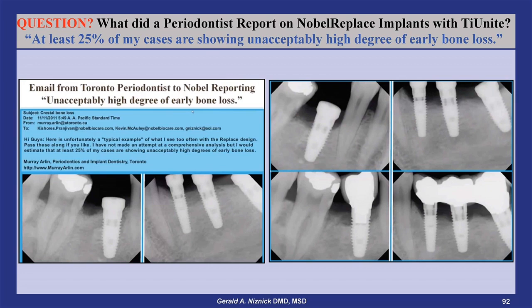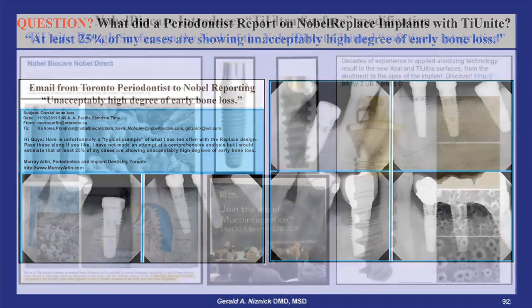I think you want to have a medium rough textured surface and you want to carry it to the top of the implant. If you have very porous bone and you want to use an implant surface that will improve your chances of success, HA coating should be considered, although not necessary with the soft bone surgical protocol incorporated into the Legacy and Screw-Vent implant systems.